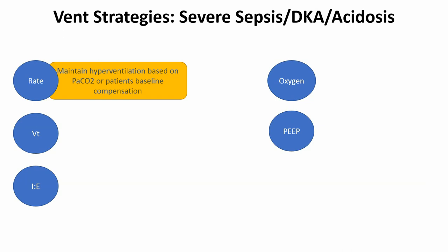So how do we know how fast to breathe for these patients? There are a few different ways. If you knew what the patient was breathing at or the rate they were breathing at before they were intubated, then you could sort of match that. Or you could put them on end-tidal CO2 before and try to match that end-tidal CO2, that's going to be lower because they're compensating.